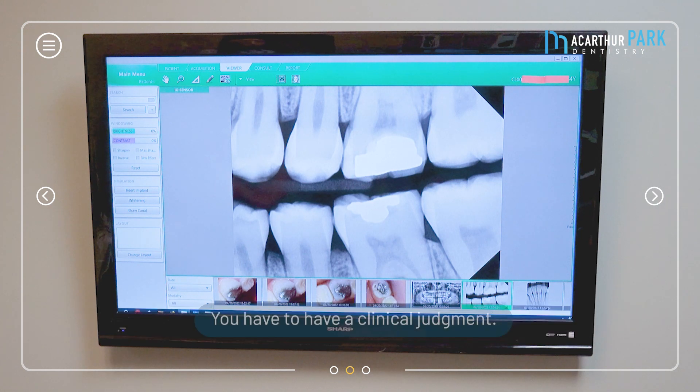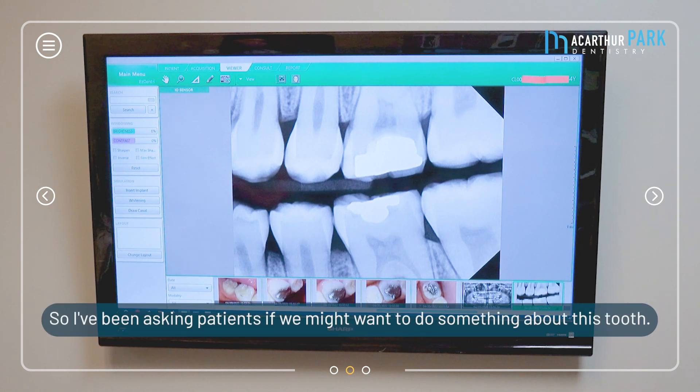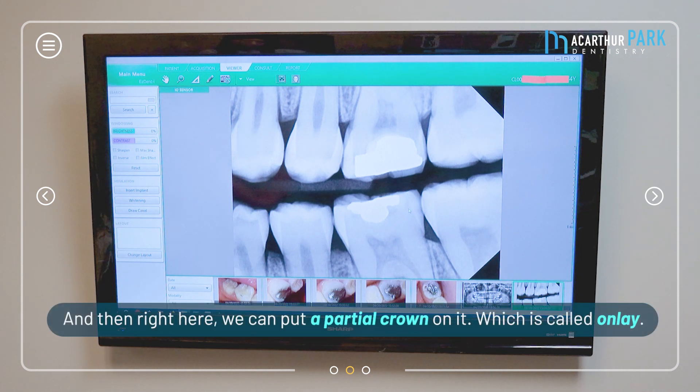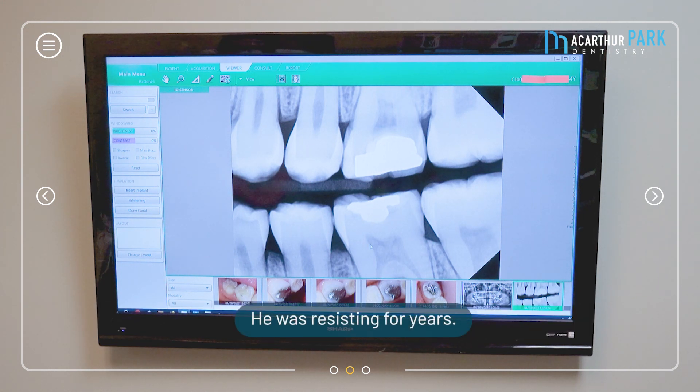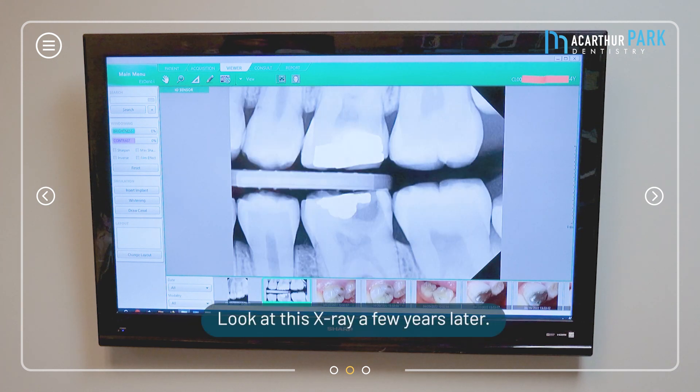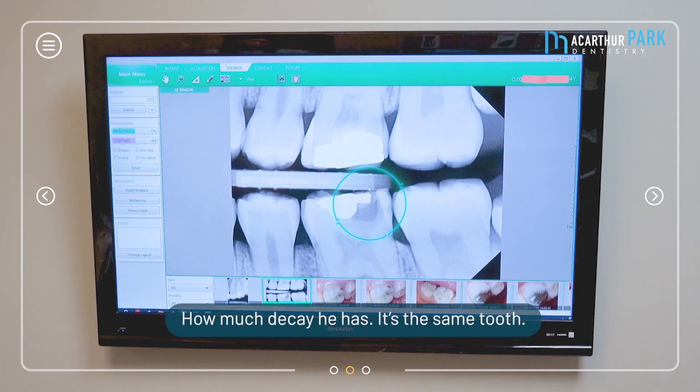I had been asking this patient that we might want to do something about this tooth — since there's something going on behind it, we could put a partial crown called an onlay on it. He had been resisting for about four years, and then he called us as an emergency patient saying, 'Dr. Koo, I need help, something happened.' Look at this x-ray a few years later — look at how much decay he has now.